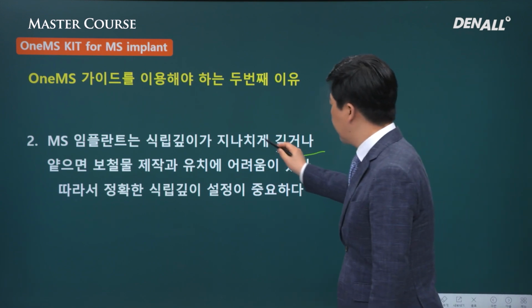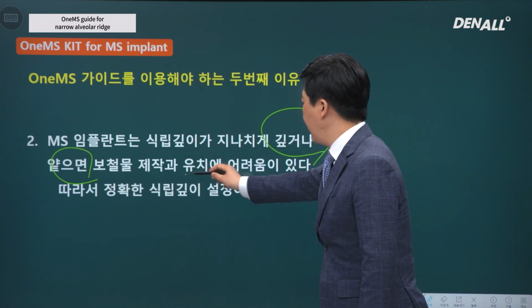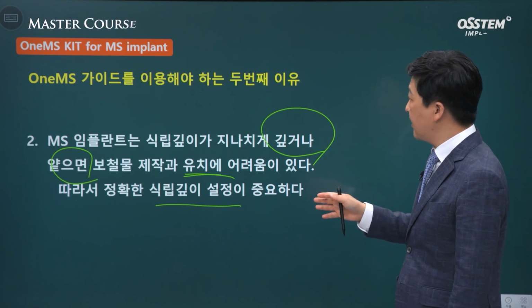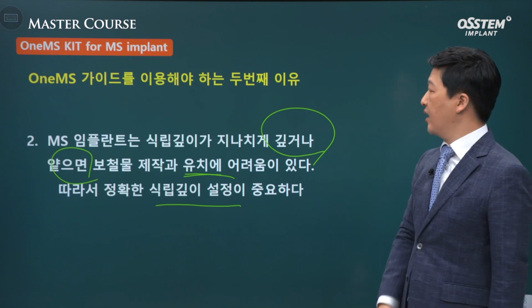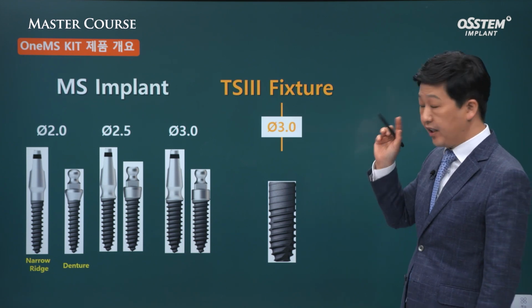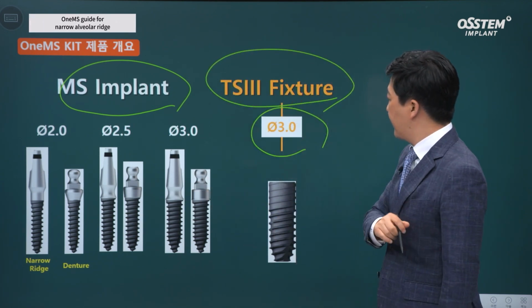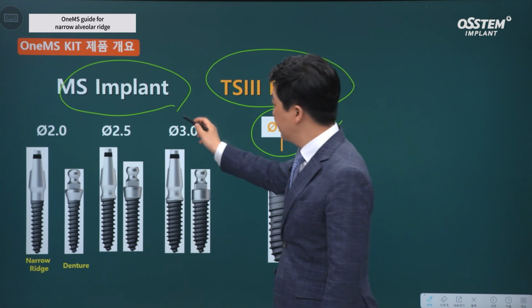If the implant has been placed too deep or too shallow, fabrication and maintenance of prosthesis can be quite difficult. Accurate placement depth is very important here. Hence, you need to use OneMS guide to place the implant in the desired position. OneMS guide can be used for MS implant and TS3 3.0 diameter implant. Today we're going to focus on MS implant. We're going to skip TS implant and focus just on MS implant.